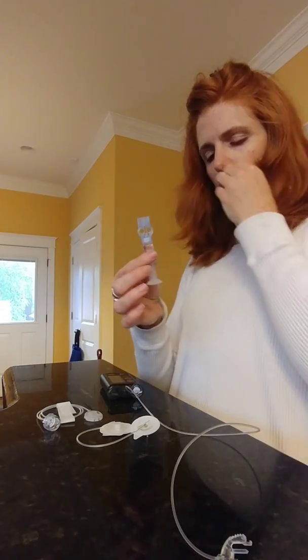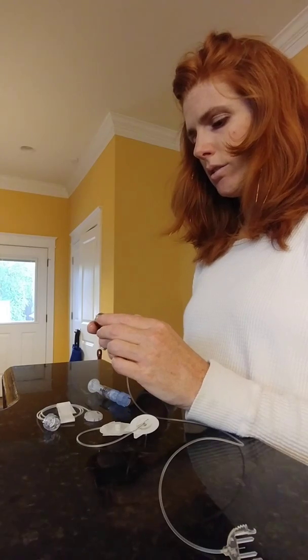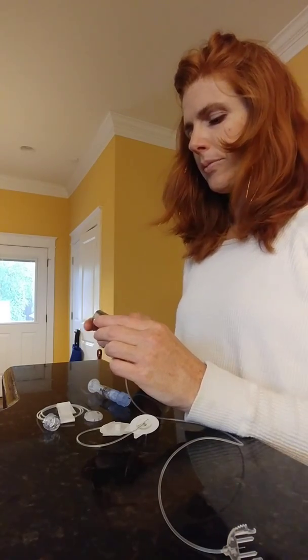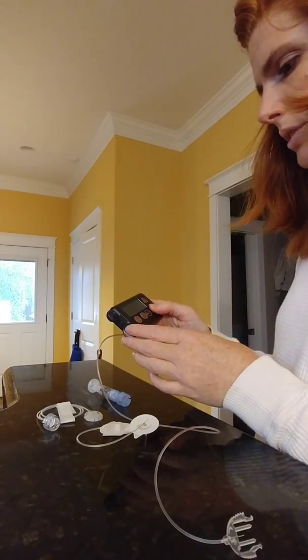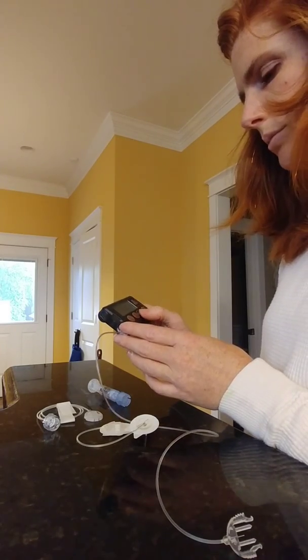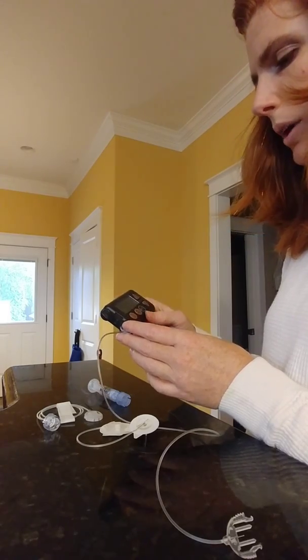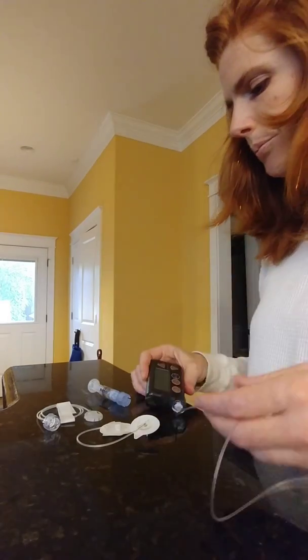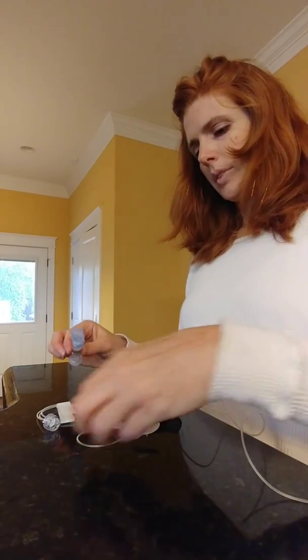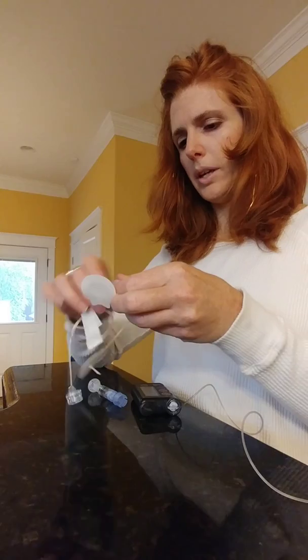So now I have the insulin drawn up, and what I'm going to do is actually on the pump, hit act, and then go down to prime, and then rewind. Disconnect it from your body, and then press act to rewind. So now as it's rewinding, I'll give it a minute, and I'm actually going to connect this site to the tubing.